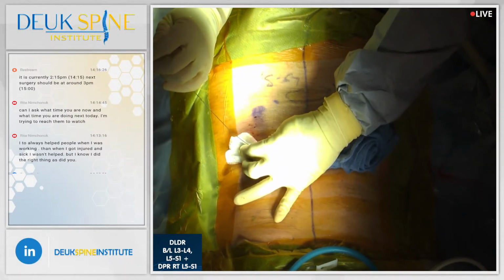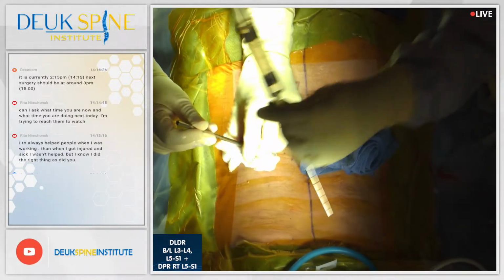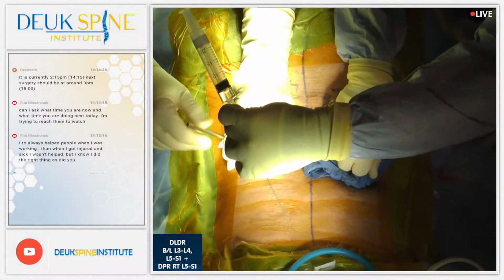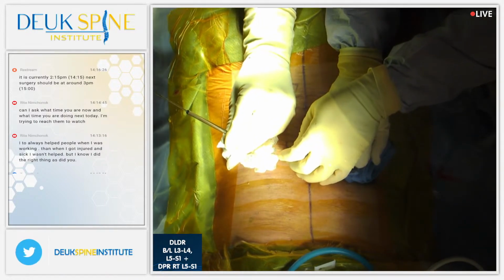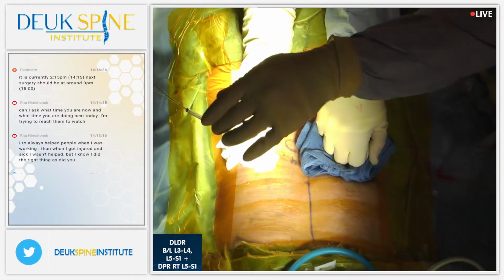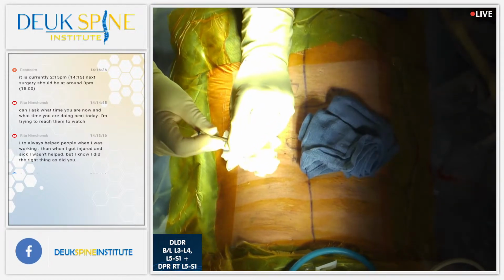Needle is out, guide wire left. Bringing the dilator down. The dilator is cannulated, meaning it has a channel inside of it that allows me to inject some numbing medicine so our patient can be a little more comfortable during the procedure, along with the anesthesiologist stuff.